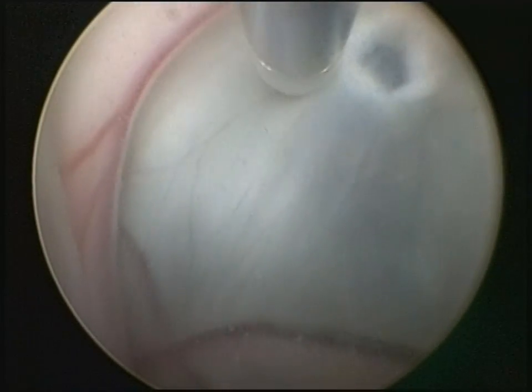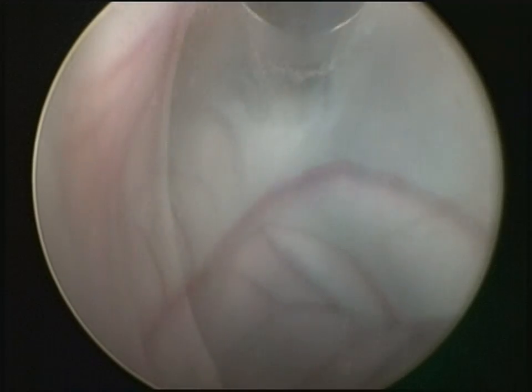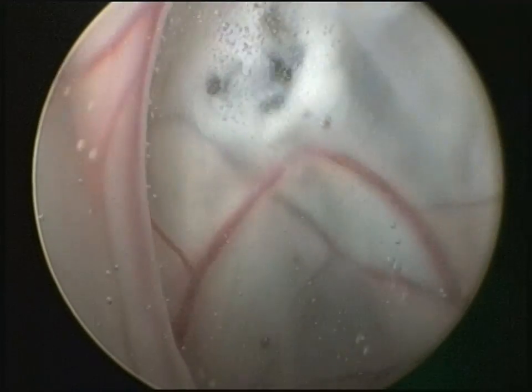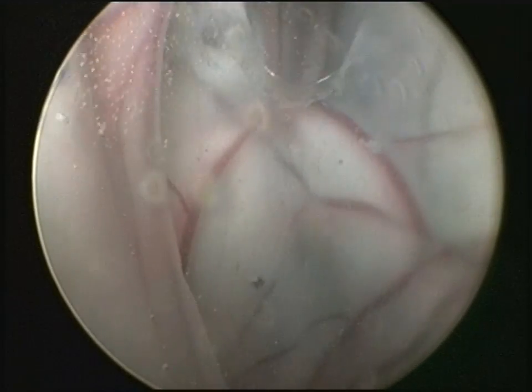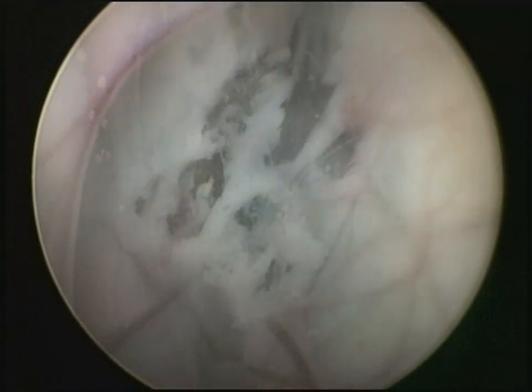Using the bipolar electrode, following circular coagulation, the remaining tissue bridges are transected with the micro scissors.